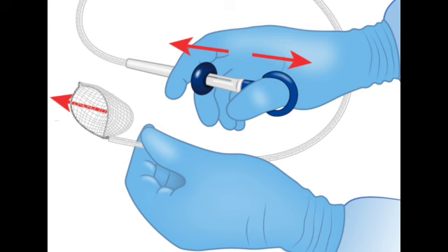Then the entire cardboard piece, with the polyp pinned to it, is gently placed into the formalin jar. Ah, I see. The cardboard keeps it flat and oriented during fixation. Exactly. It preserves that crucial information about the margins, which can directly impact decisions about further treatment for the patient. It's a small step with potentially huge implications.